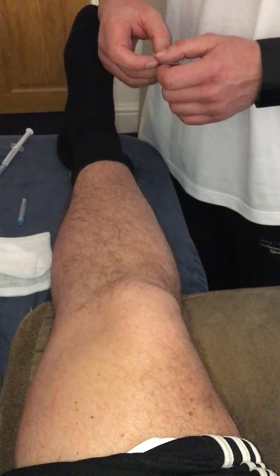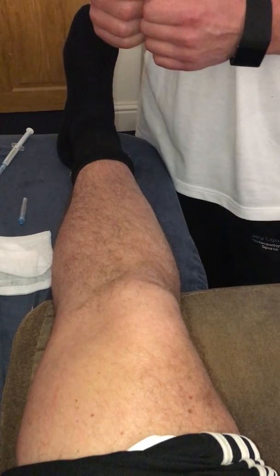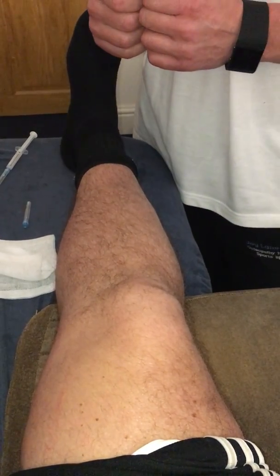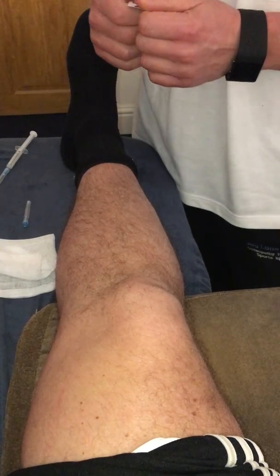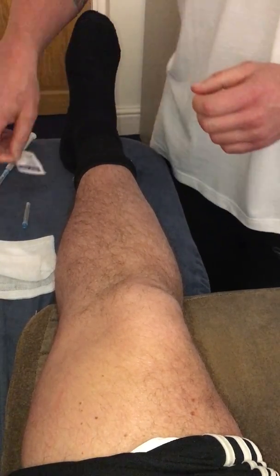Hi, Charlie Baneen here again, sports osteopath. Today we're going to inject an infrapatellar tendonitis which has been chronic over the space of the last couple of months and hasn't responded to treatment, so we're going to mark up the area first.